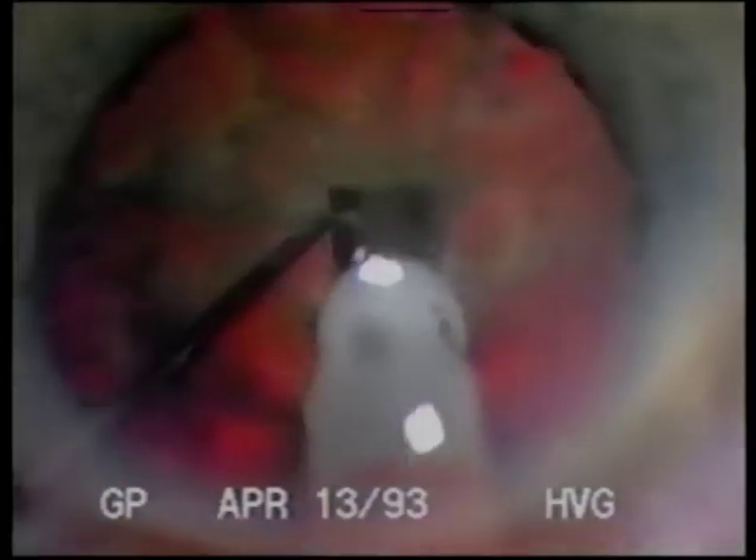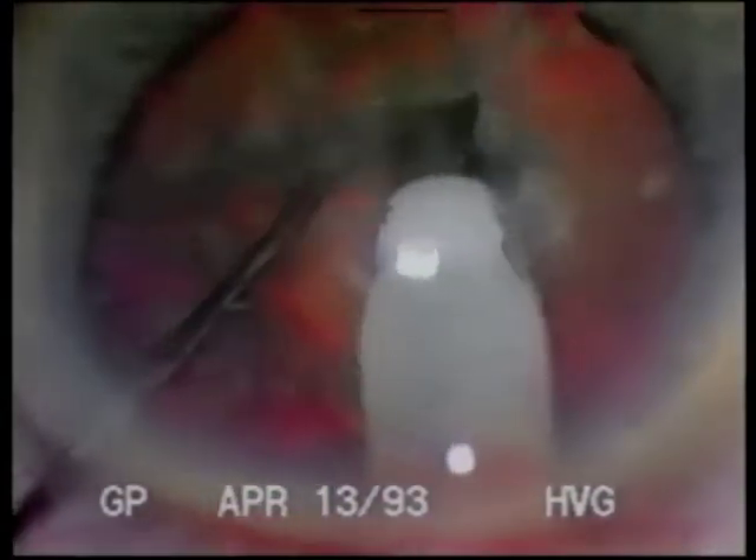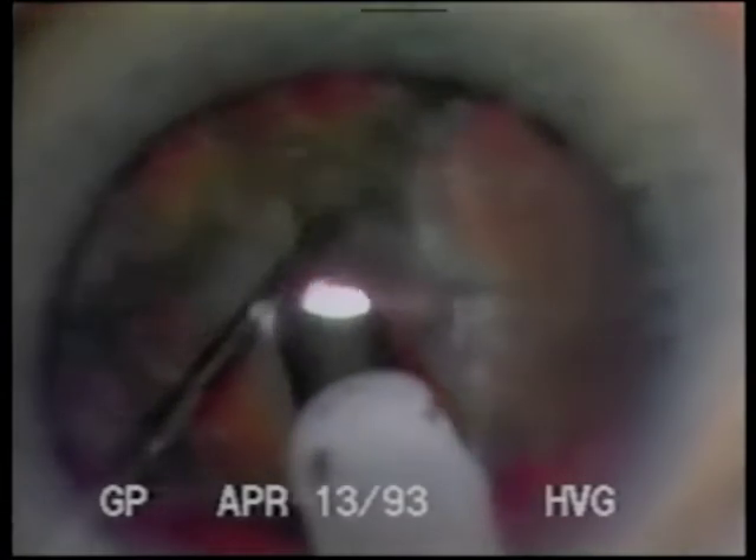Down-slope sculpting is my current refinement to the divide-and-conquer nucleofractus technique of phacoemulsification. Notice that the second instrument is stabilizing the nucleus for debulking the upper portion of the lens. A small groove is made and then, stabilizing with the spatula and pushing to the right with the phaco tip, a vertical fracture is created. Subsequent radial fractures in the nucleus are created, dividing it into approximately six segments.